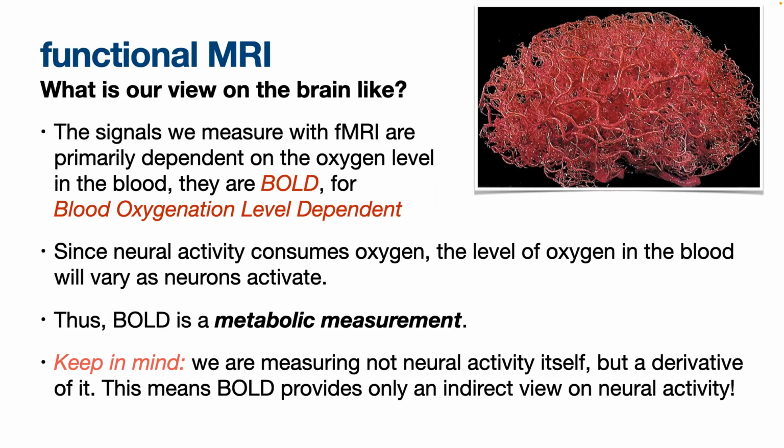So this is functional MRI. I'll get into the functional versus anatomical thing in a bit. But one thing to be very aware of, and let's take a step back: one thing that I'm going to be teaching you is that fMRI is mostly nonsensical. That might sound weird from the teacher right now at this point. But what you have is a measurement technique that is very noisy. It's not measuring exactly what you want it to measure.